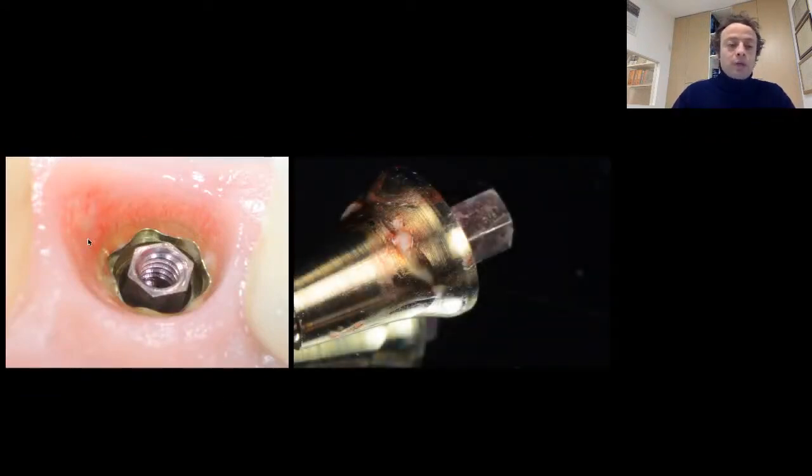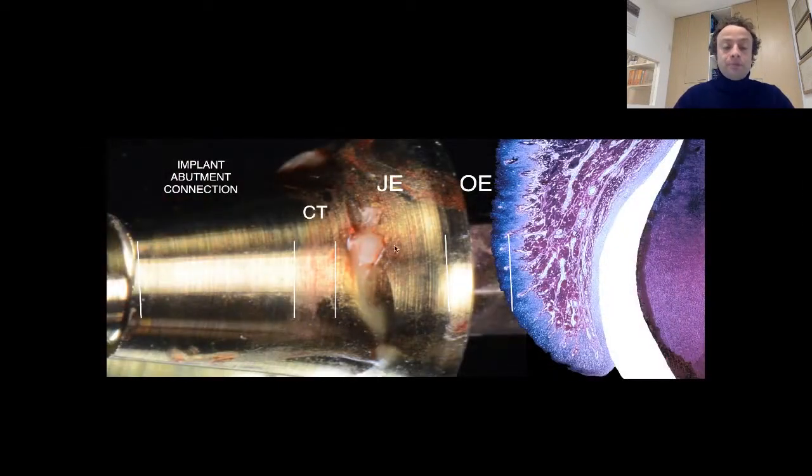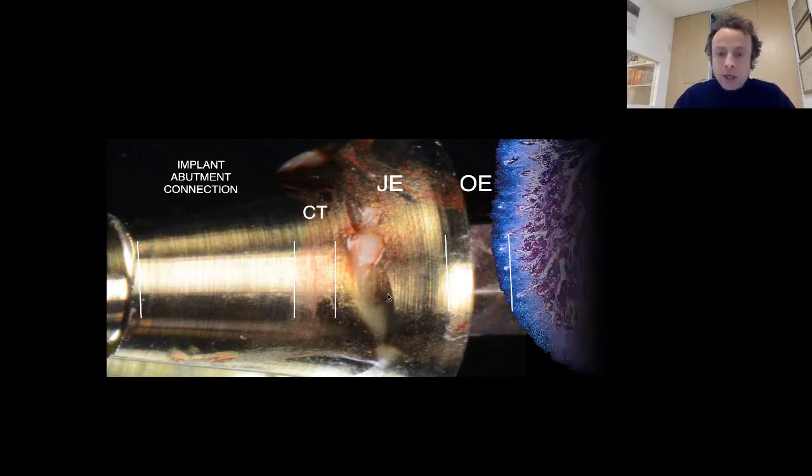And I like to work with this kind of multi-unit abutment, or this intermediate abutment, also in the full edentulous patient, because with this approach on this patient we can really get great soft tissue adhesion. And it means that you are able to create really good mucosal integration. And remember that if we have a good mucosal integration, it means having also a great bone integration, because the soft tissue seal represents a protection for the bone.